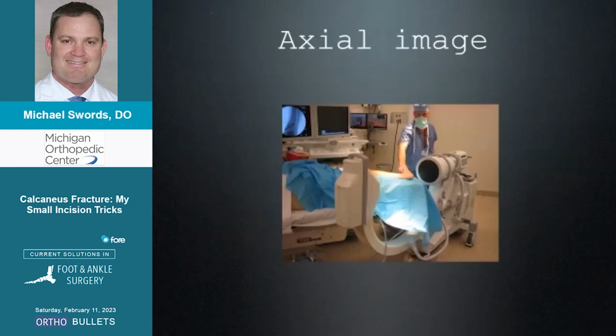I don't have to lift the leg up. I don't have to move it. And I can do this by myself, just like Sam said. I don't need additional hands. I use the real C-arm, not the mini one.